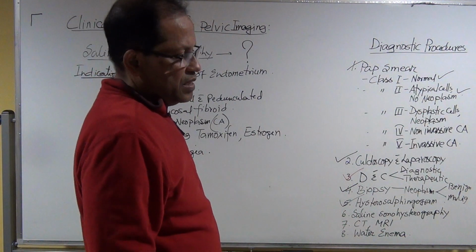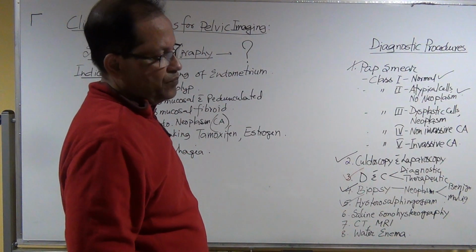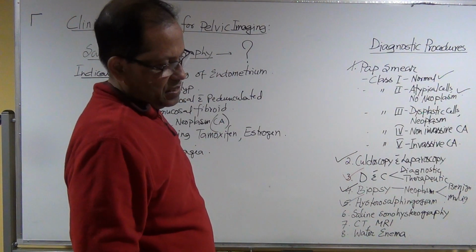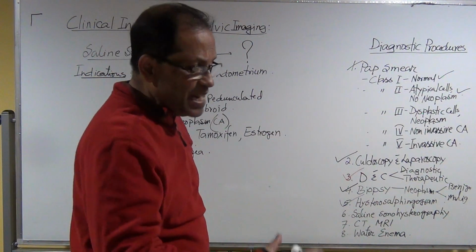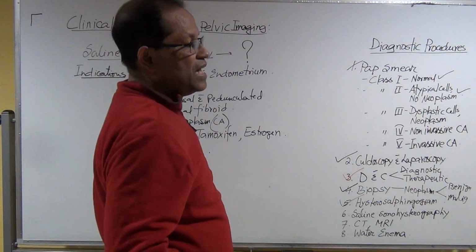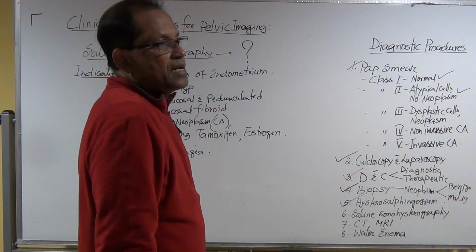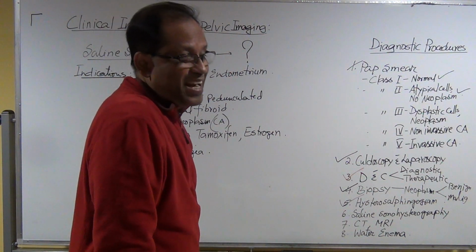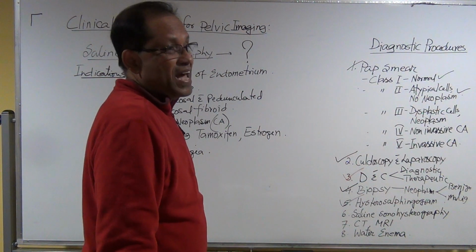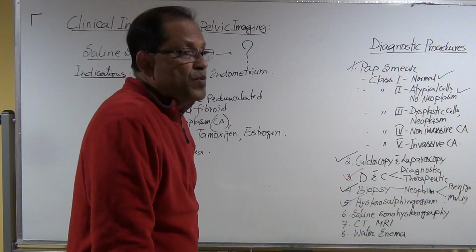Keep that in mind. The endometrial cancer is attached with the wall, widely attached, with a hypervascularity, irregular margin. I like to see that. How are we going to see? That's why I am injecting the water inside the uterine cavity, making it wider. It will also give us the anechoic area. So anything against the background of anechoic, everything is clear. I will see this.